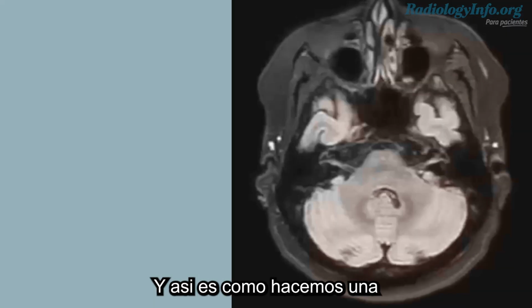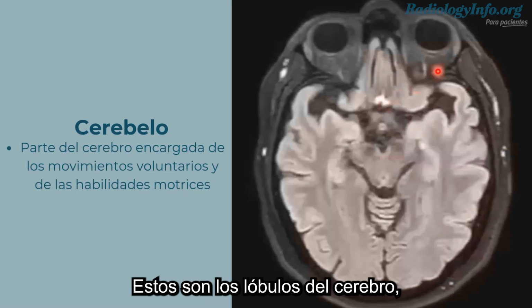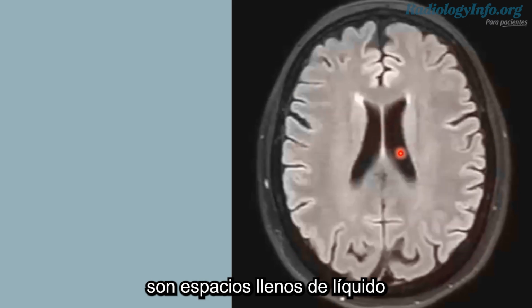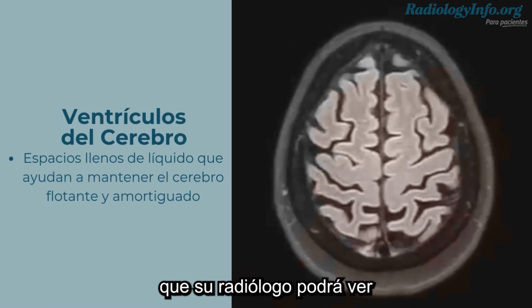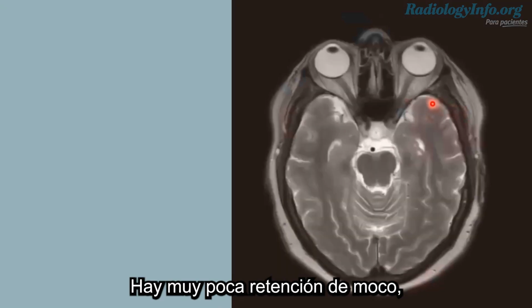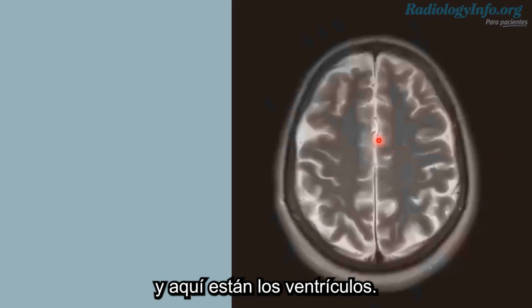And just scrolling through the brain, this is the cerebellum here. These are the lobes of the brain. These are the eyes. These dark spaces here are fluid-filled spaces, ventricles. This is the type of thing that your radiologist is going to see when they're interpreting the exam. There's a little mucus retention cyst we just saw in the left maxillary sinus. Here's the brain tissue and the ventricles here.